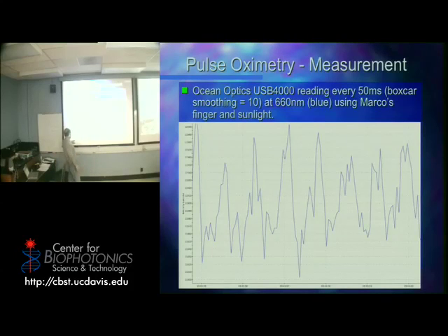And this is a span of 5 seconds. So in 5 seconds I had 1 beat, 2 beats, 3 beats, 4, 5, 6, 7. So that means my heart rate was, you guys figure that out? What was my heart rate? This was 5 seconds. I had 7 changes.